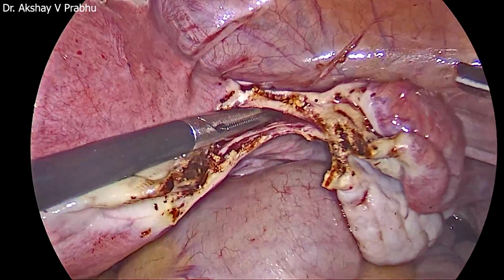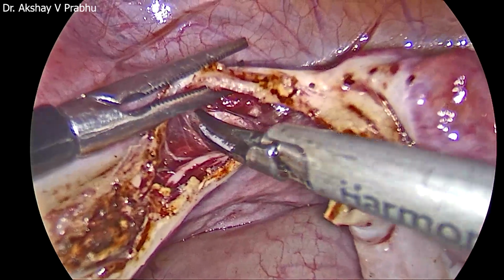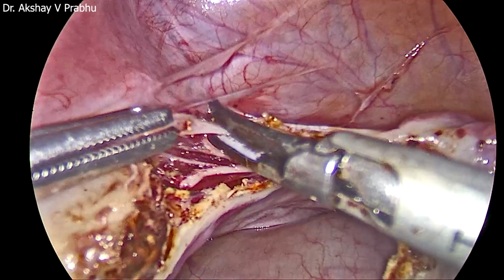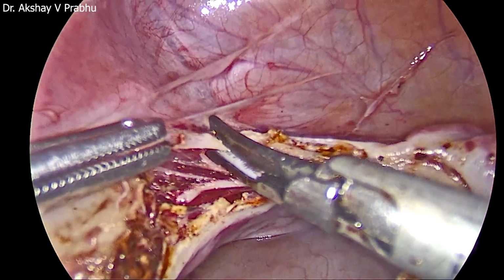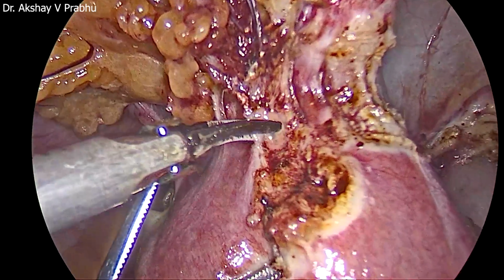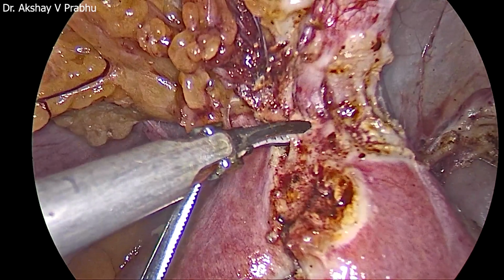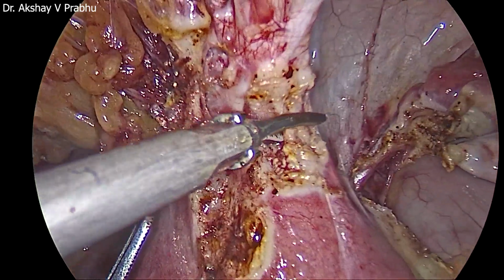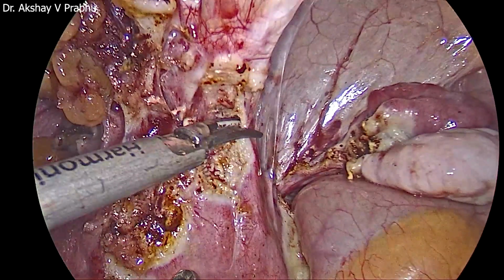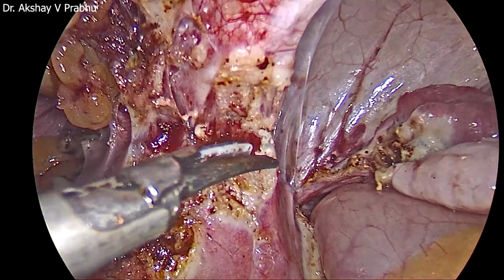Left side I was not successful, so I've come to the right side. Broad ligament was opened earlier. These are all virgin planes. If you can see, the characteristic areolar tissue is maintained. So I'm again going millimeter by millimeter, the anterior fold of the broad ligament. This is basically a combination of lateral dissection and central dissection to locate the bladder and to tackle the bladder. And during the entire process, the uterus is put on stretch, so that with every single cut of yours, a new plane will be exposed.